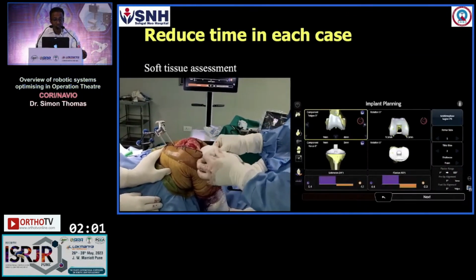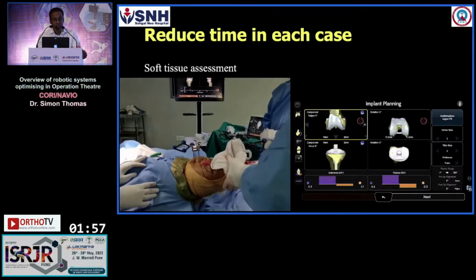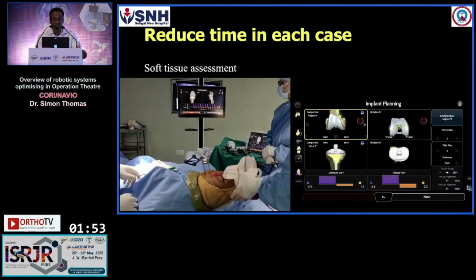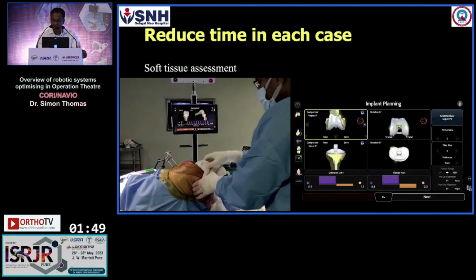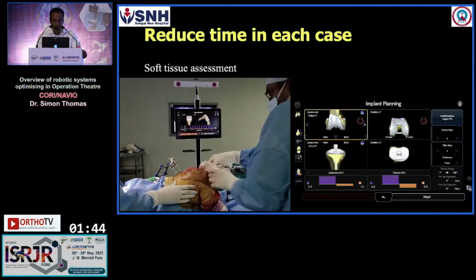For the soft tissue assessment, Dr. Krishna Kiran showed this spoon today. The spoon used to slip out of my hand, but over a period of time what I did was keep some mops so that the friction increased. It gave stability, and it did not slip out. And I realized that I could use this better with this little piece of mop.